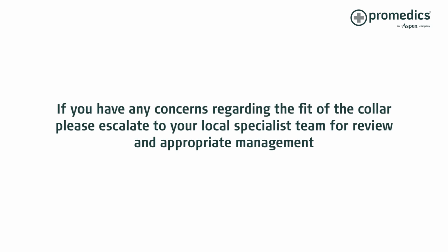If you have any concerns regarding the fit of the collar, please escalate to your local specialist team for review and appropriate management.